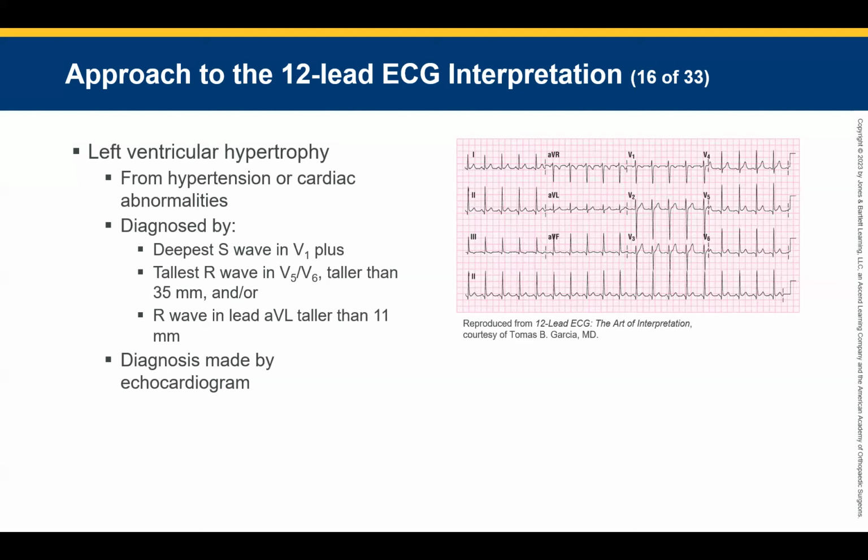What are the arrows indicating? These are indicating our contiguous leads, meaning they're partnered. We need elevation here and here to be a team. Here, two of these three need elevation. Both of these need elevation to be a STEMI. The inferiors are paired and laterals are paired here.